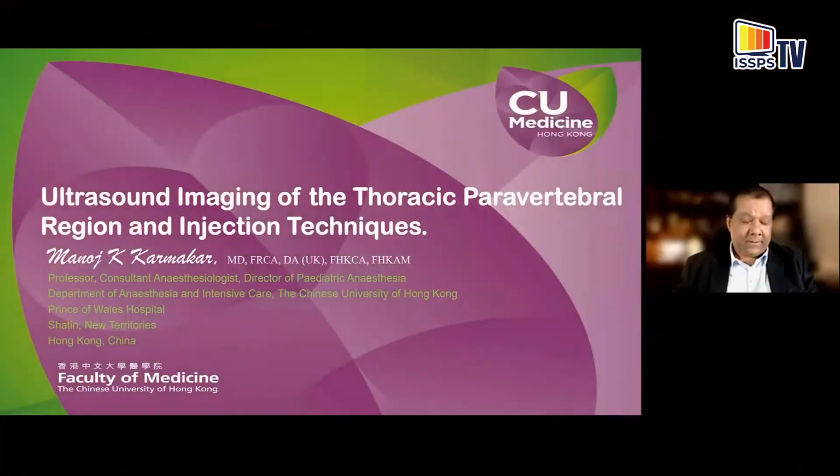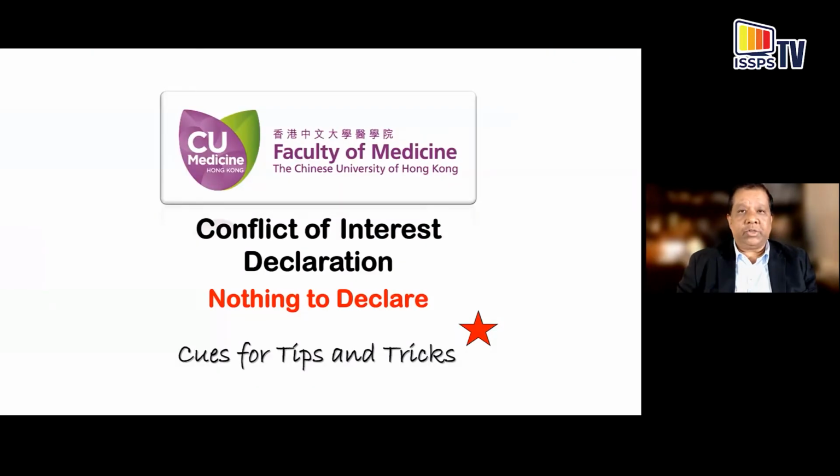Ladies and gentlemen, for the next presentation, I'm going to share with you our insights into paravertebral sonography and ultrasound guided paravertebral blocks. As we have already discussed, there are some new concepts, but I will try to stay away from them because we still need to validate some of this in clinical practice. But nevertheless, these are interesting times and you will hear a lot more, so you should stay tuned. I will refer to this aspect in this presentation.